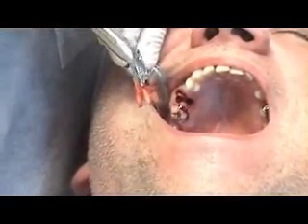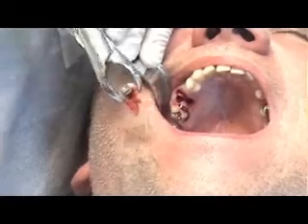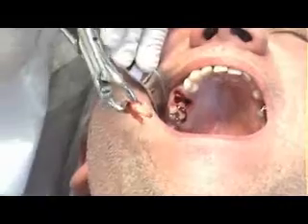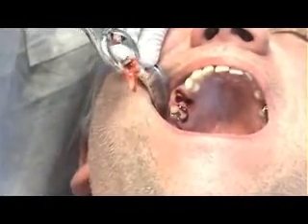All right, Doctor, if you can show the roots on that tooth again so everyone can see what it looks like. Roots coming out perfect. There we go. It's got three roots — one, two, and three — and you can see that's where the big hole was on the back side of that crown. It all came out in one piece. That's a great shot. And there's some gold in there so if he wants his gold he can take it.